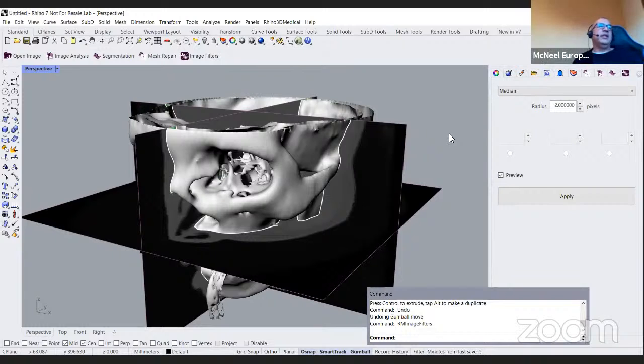Sure. Right. Titanium is too expensive for just using as a guide, I guess. No, but it would be easily approved. But for cutting guides, it should be titanium. Yeah, for cutting, and for drilling, probably. Well, I'm not an expert in the field. I mean, for the guides that later you are throwing away, that are just supports.